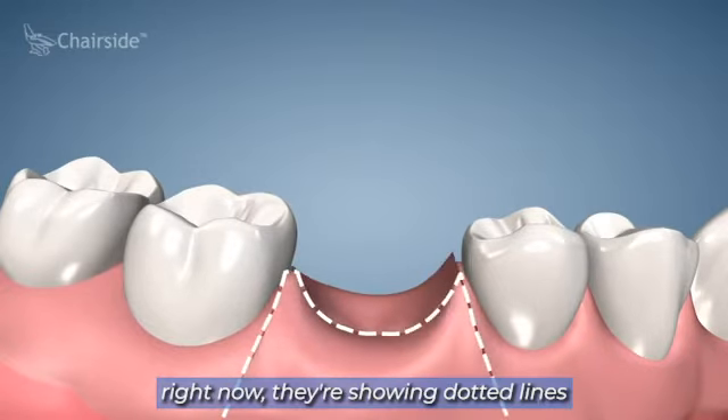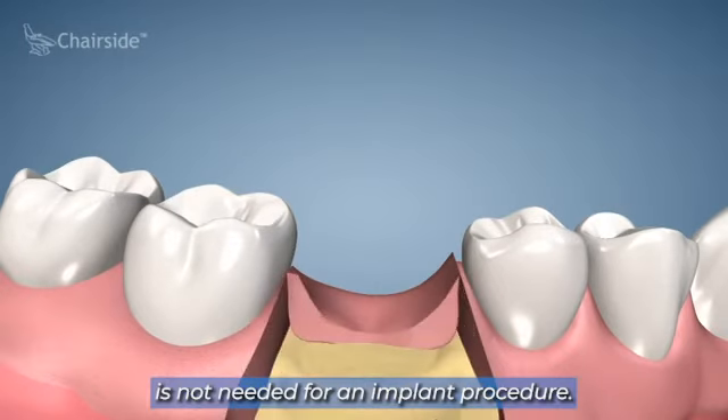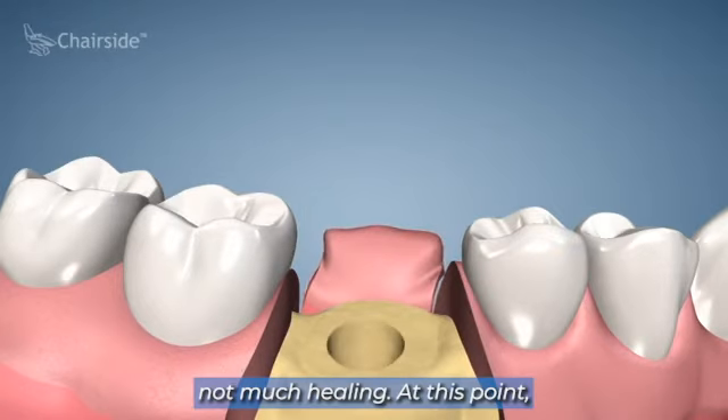In the video right now they're showing dotted lines to demonstrate flapping the gum. That typically is not needed for an implant procedure. Usually we just make a small tissue punch right where the implant's going in. There's no stitches, not much healing.